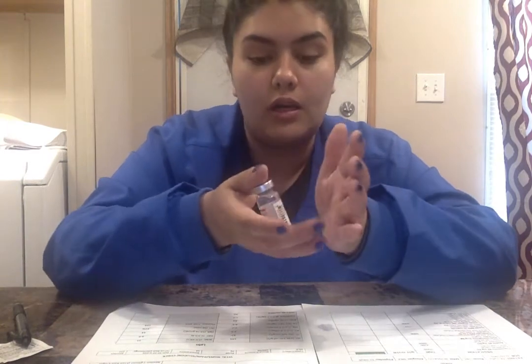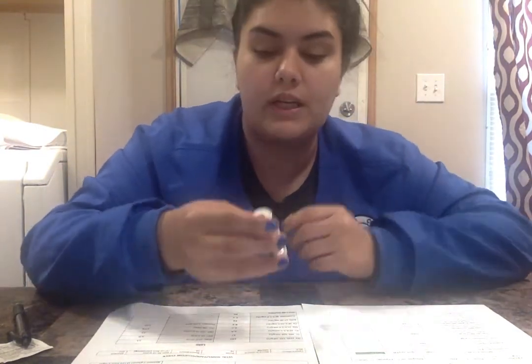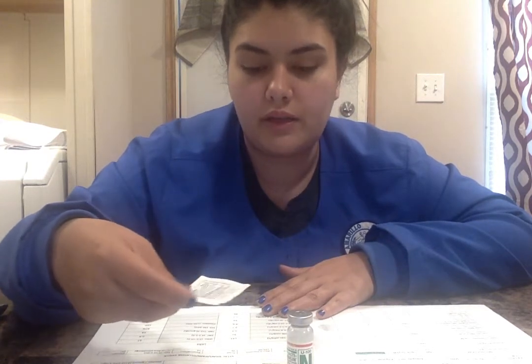And so now I'm going to show you how to mix insulins, even though we're not mixing any right now. Since this is NPH, it has particles at the bottom. You want to mix those particles up, but you do not want to vigorously shake your medication. You want to roll this in between your hands and make sure that you got all those particles mixed up really good. And then you're going to call over your second nurse, and you are going to clean the tops of your NPH and the top of your regular insulin that you're mixing it with.